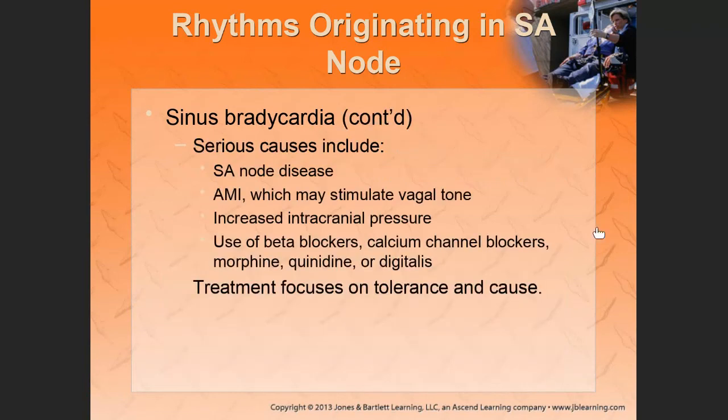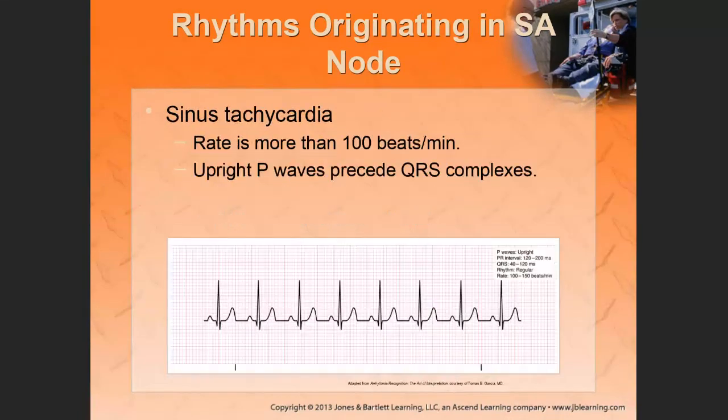All right, now let's look at this one. Oh, not this one. Let's look at this one. Does it look pretty or does it look ugly? And when I say if it looks pretty, I mean if you can see all your waveforms. So can you see your P waves clearly? Are you seeing your P waves?